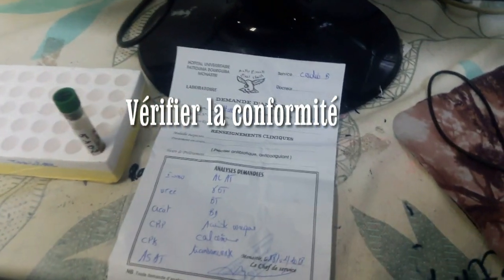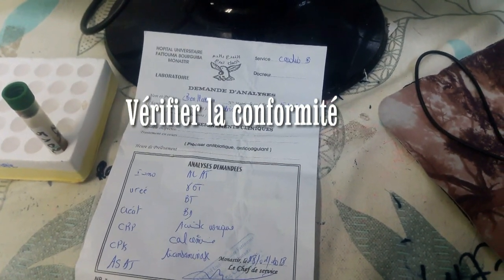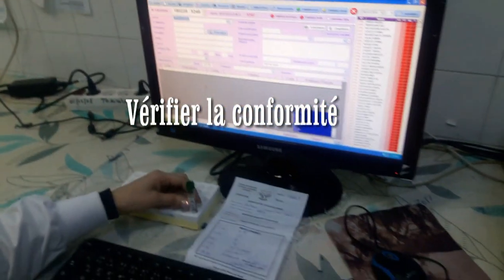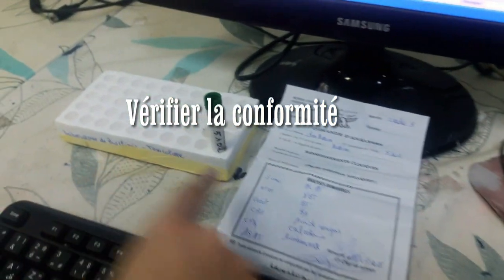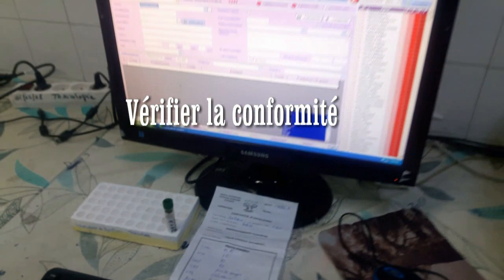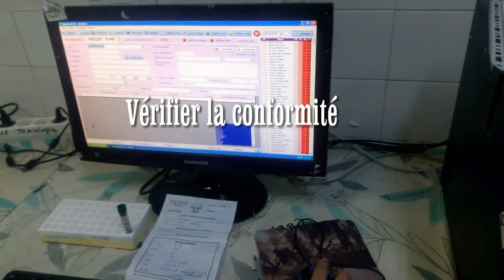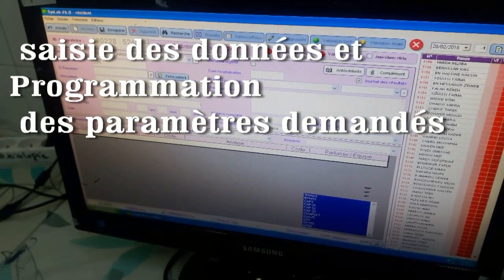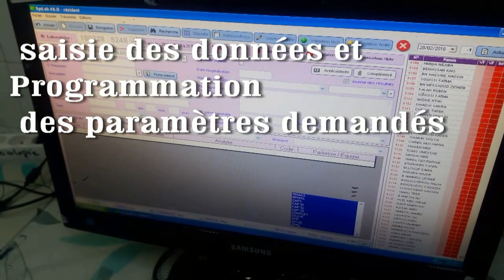Voilà un exemple de demandes d'analyse acheminées au laboratoire. Il faut s'assurer que la matricule sur le tube soit la même sur le bon. Donc on commence la saisie. Cardio B — les initiales C, B. On passe. L'année, la matricule. Entrée.